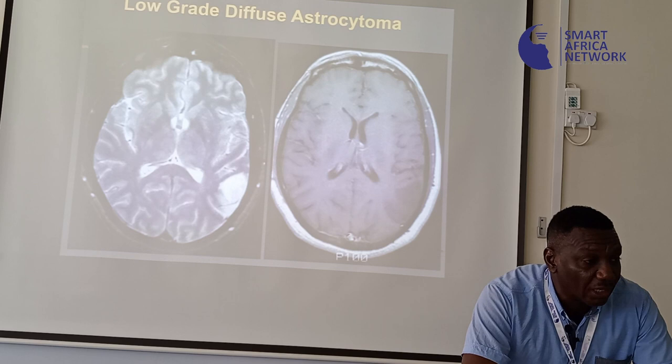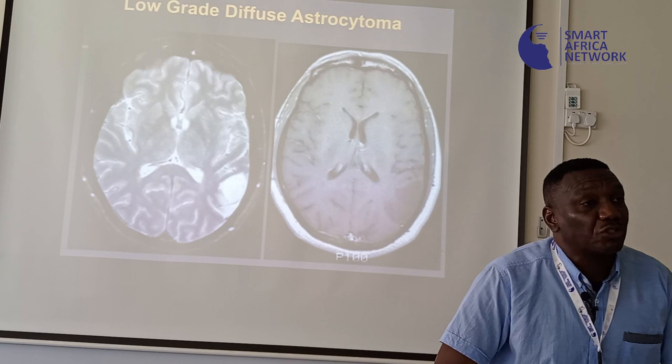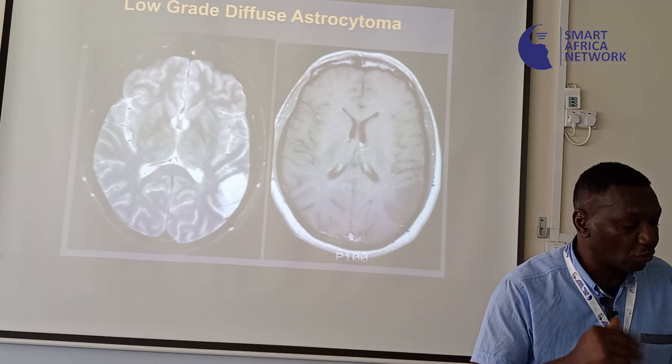The other thing you also need to know is that blood vessels that have fluid within them usually will not show any signal. Anything that is moving usually will not show any signal.